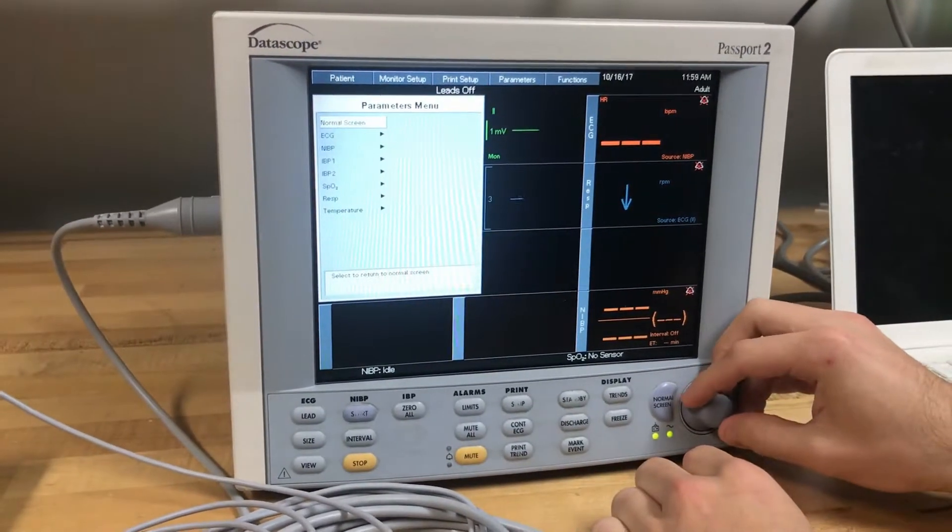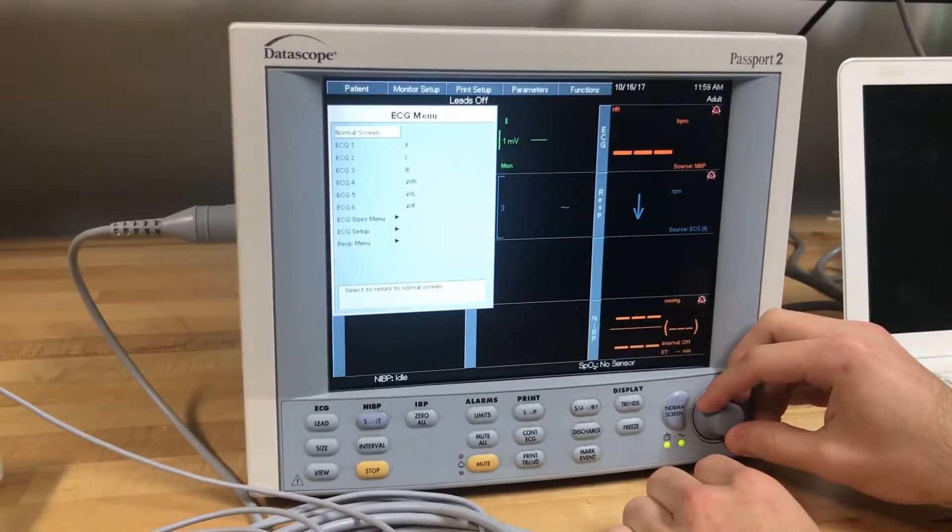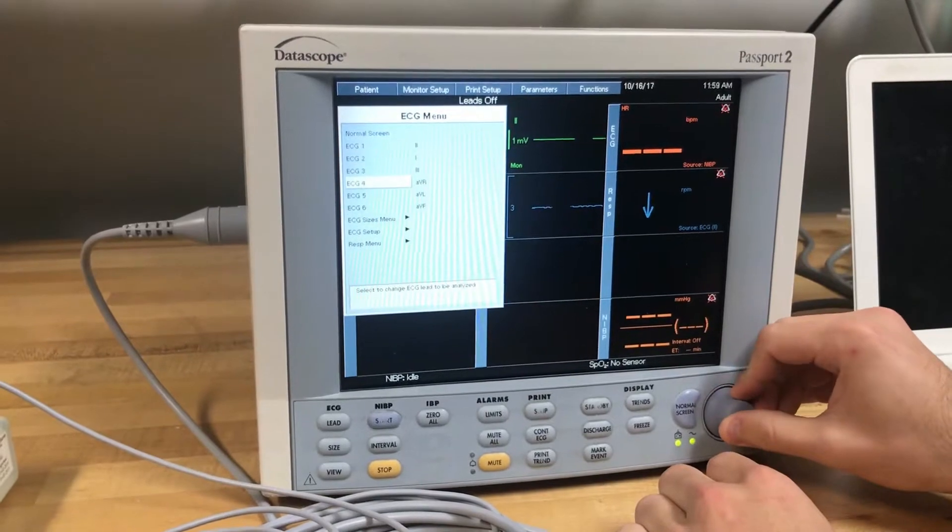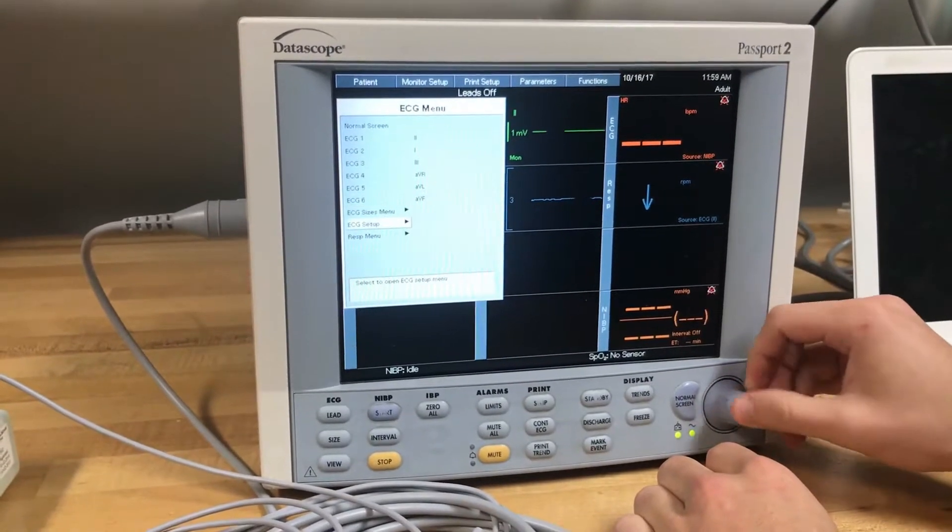Scroll down to ECG and hit select. Scroll down to the ECG setup and hit select.